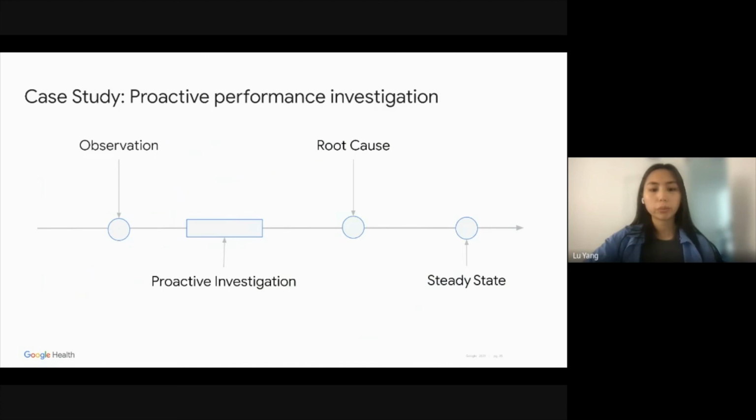We worked through various potential causes of observed performance variation, and we were finally able to narrow down to the root cause, which is unfamiliarity with the new camera setup in the site. We work with partners to improve operator training. Finally, we continue monitoring DR performance through the established monitoring process. And as the sample size of patients increased, we noticed a consistent performance.